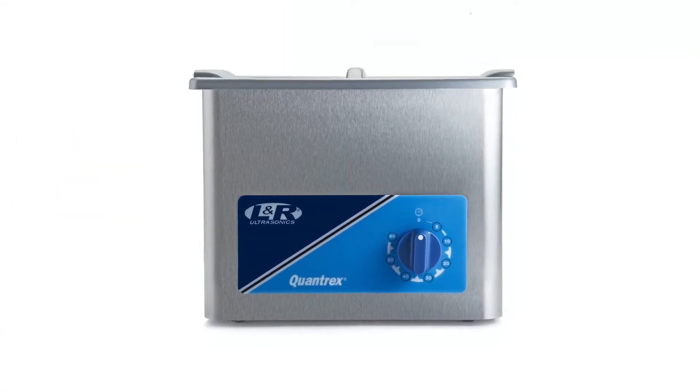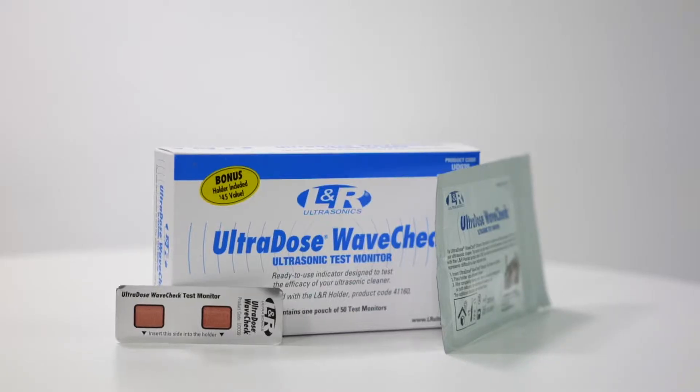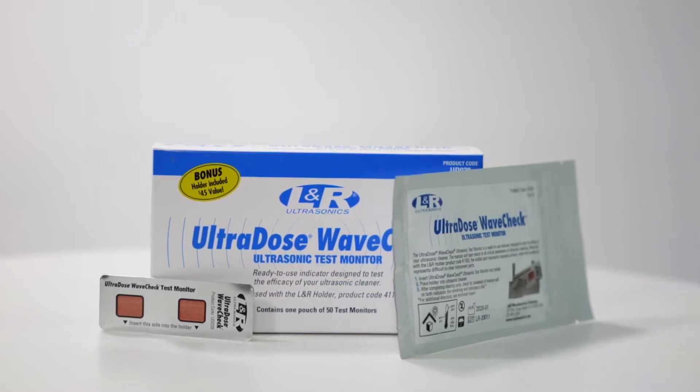your ultrasonic cleaner must perform properly and work in conjunction with the ultrasonic cleaning solution. LNR's UltraDose WaveCheck is a ready-to-use indicator designed to test the efficacy of your ultrasonic cleaner.